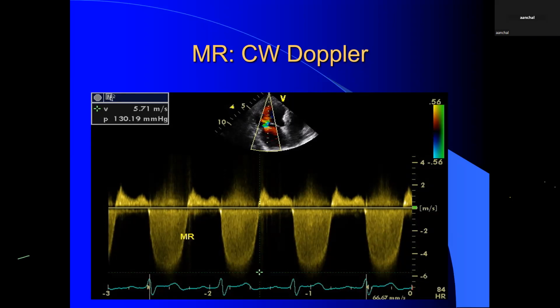Yes, sir. My question is regarding the Nyquist limit. I'm not sure if it will be covered in future topics. No, go ahead, ask your question right now. Say the Nyquist limit has been set up. I'll not go into the physics of the Nyquist limit, which is very complicated. The Nyquist limit is the maximum measurable velocity by a pulse Doppler beyond which aliasing occurs. So suppose the aliasing occurs at 1.7, we say the Nyquist limit is 1.7.